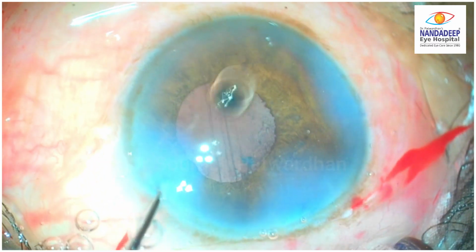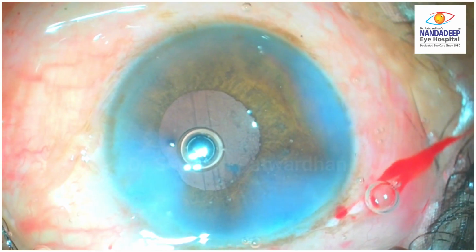So in this way we could manage the situation and could complete the IOL insertion in the same sitting.